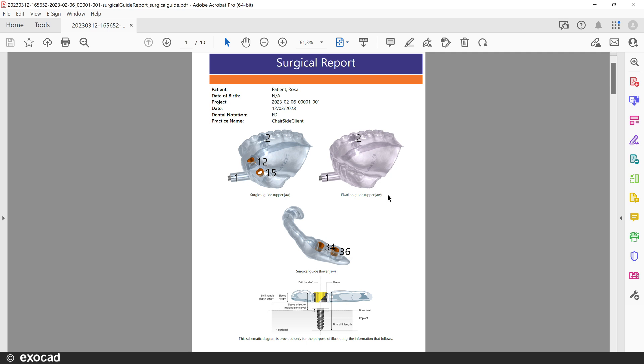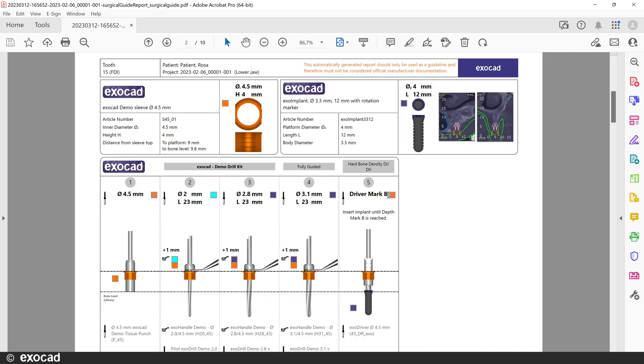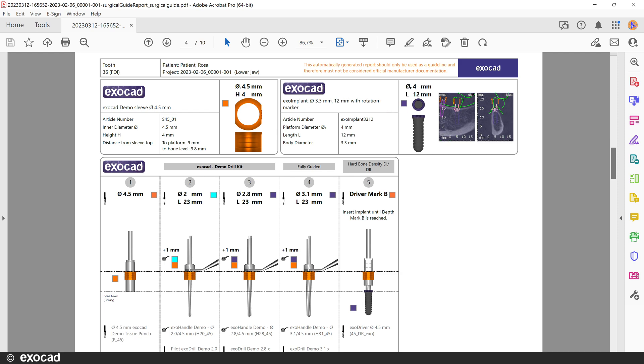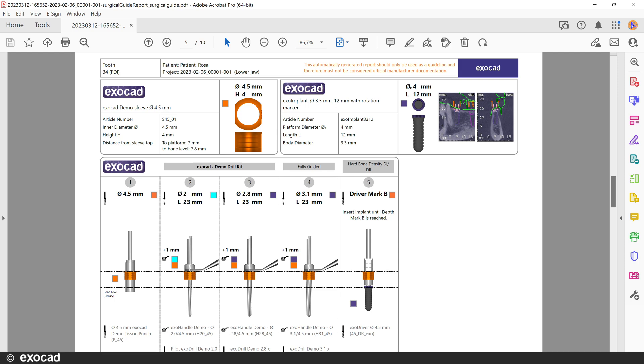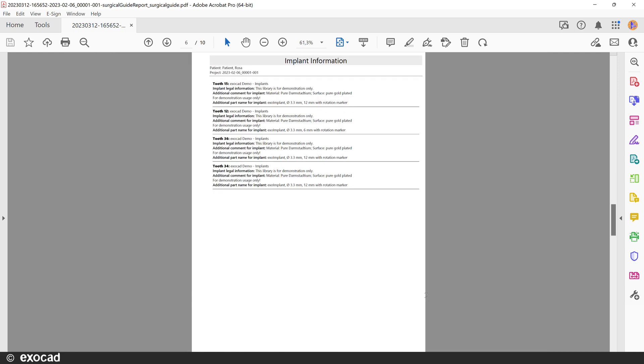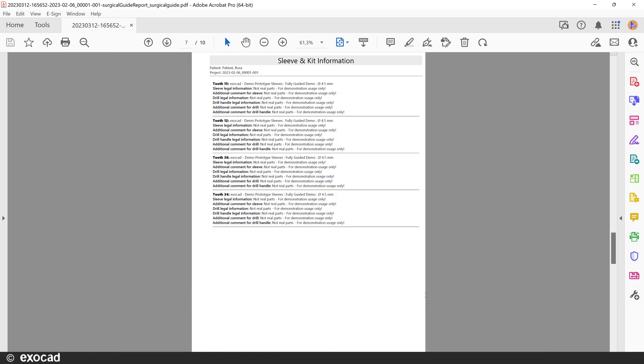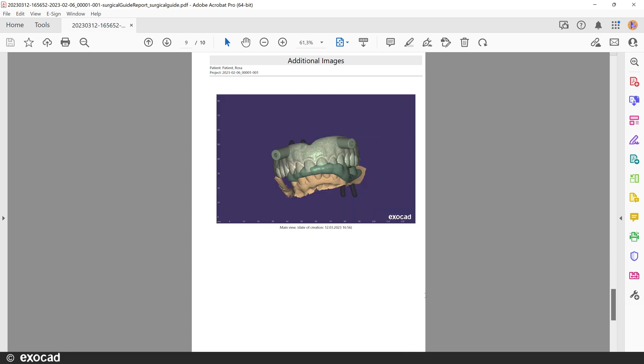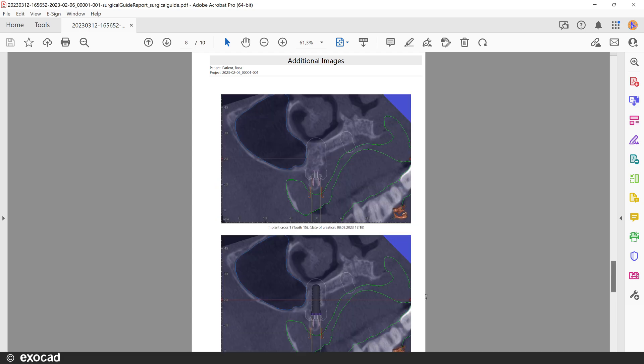Now we can take a look at the surgical guide report. New is that we now display the full drill sequence. This feature is available for those implants and surgical kits for which the manufacturer has chosen to integrate the full drill sequence in our software. In the full drill sequence protocol, each step during the surgery is listed if you have chosen a fully guided system for which the full drill sequence has been implemented. At the end of the report, we can see the screenshots I selected to include in the surgical report.